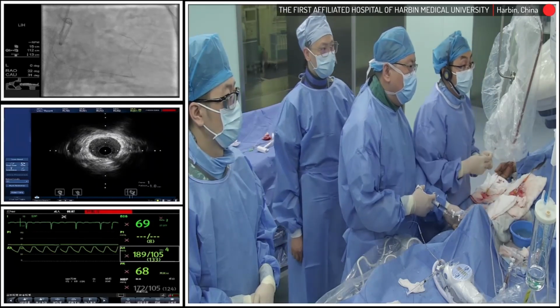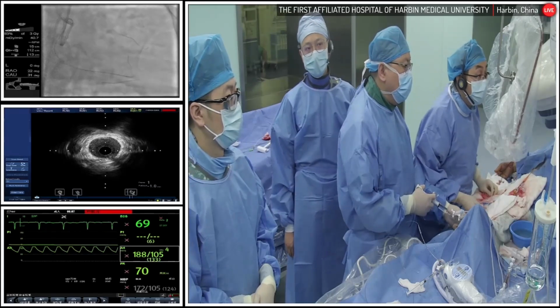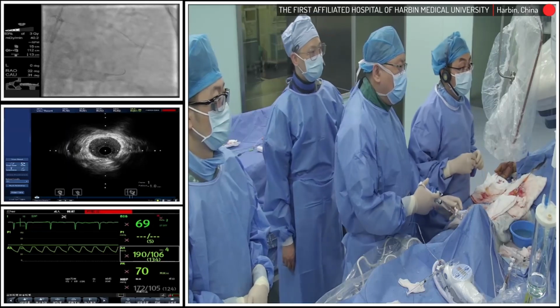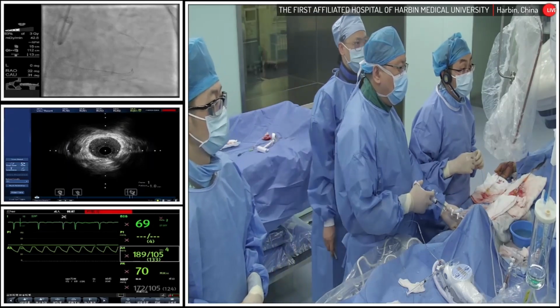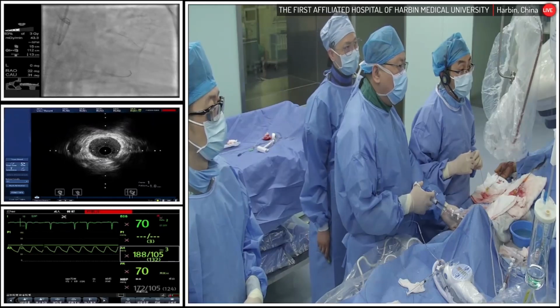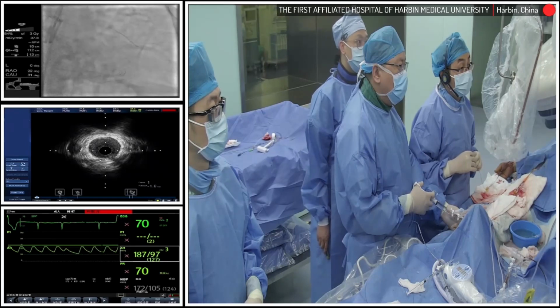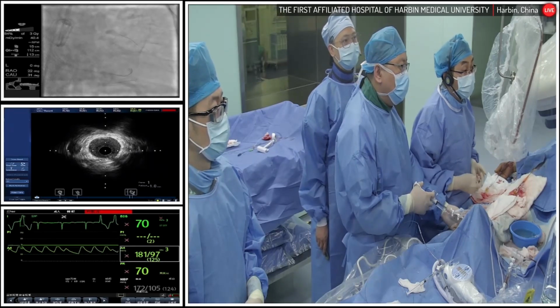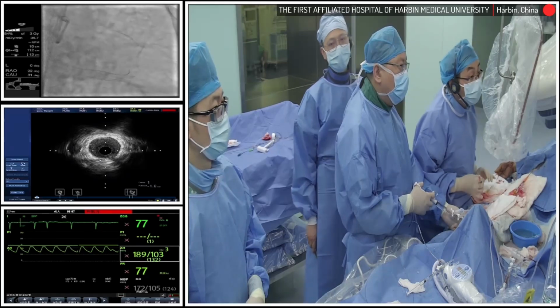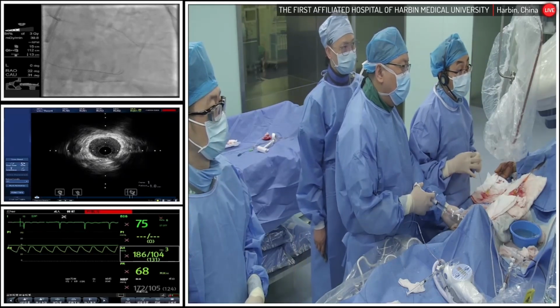Today, Professor Gong is going to perform a very complex CTO case with a blunt tip totally occluded LAD. Next, I will introduce the leading operator of today, Professor Gong Yongtai. The second operators are Dr. Sun Danghui, Dr. Wang Dingyu, and Dr. Zhao Hongwei. I'm the moderator for today, Cao Yang from the Cardiovascular Department.